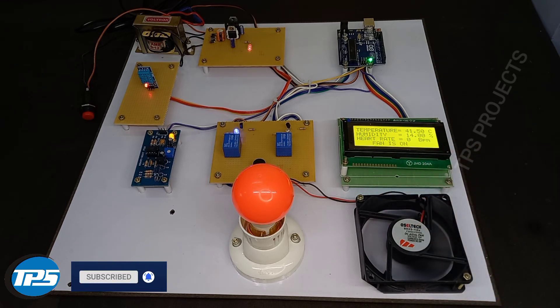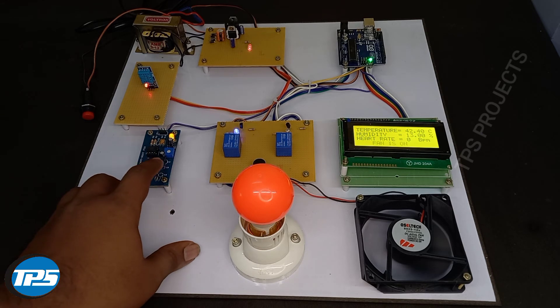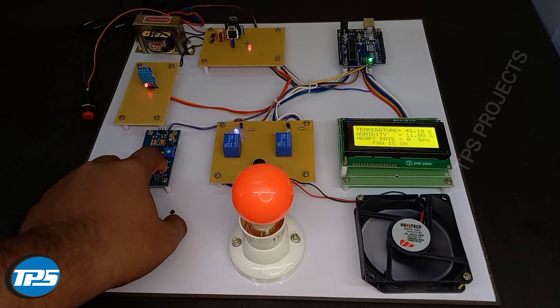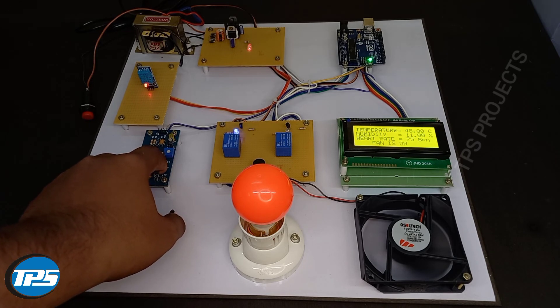Now you can see the heartbeat sensor functioning, and the heartbeat rate is shown on the display.